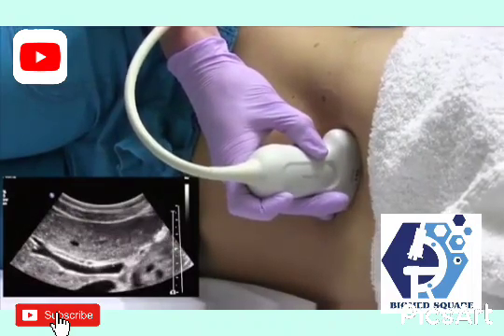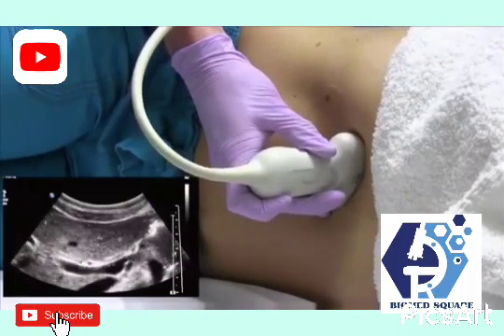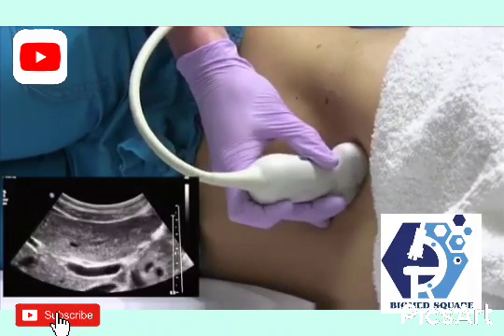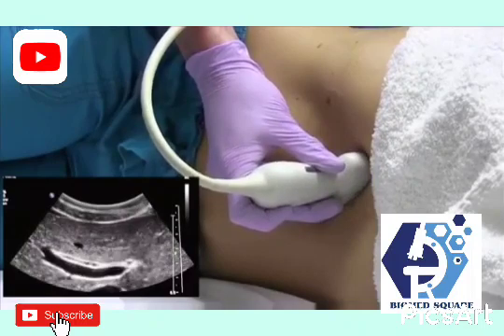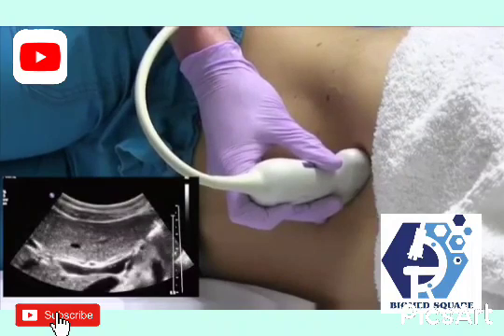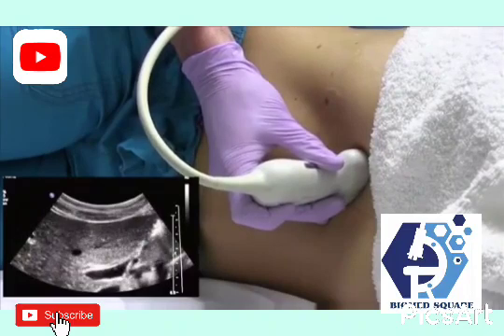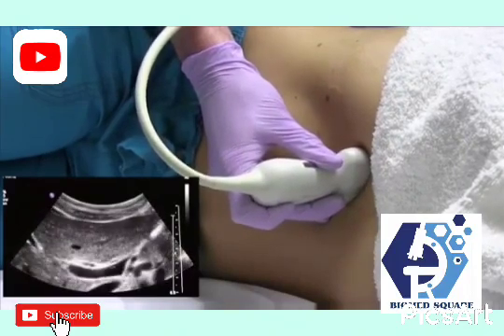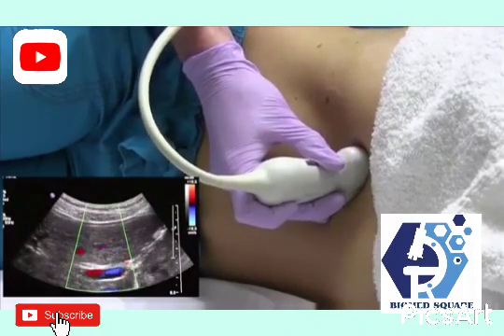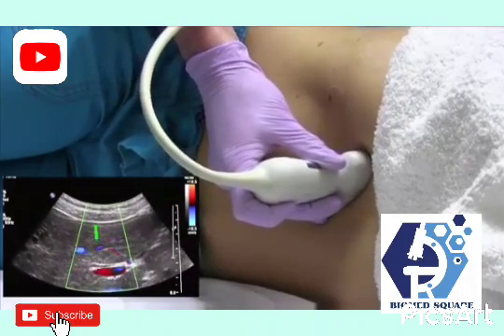you know that the CBD and the hepatic artery are right next to each other here. So you just keep tweaking the probe until you elongate one of these tubular structures next to the main portal vein. And the easiest way to see if you're on the hepatic artery or the CBD is to just turn on color and see if it lights up. If it lights up, you are on the hepatic artery, and if it doesn't, you know that's the CBD.